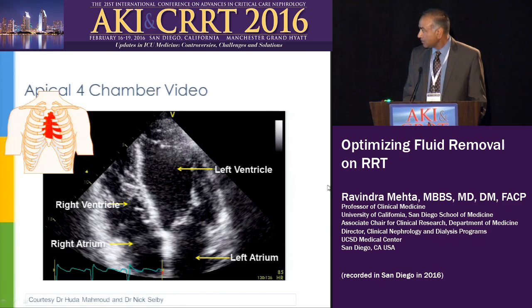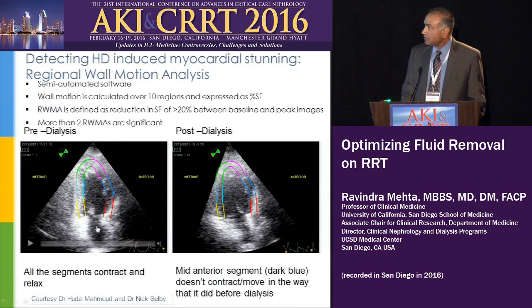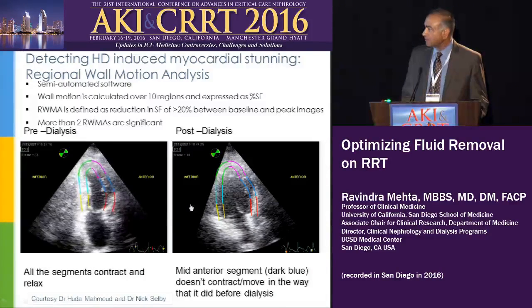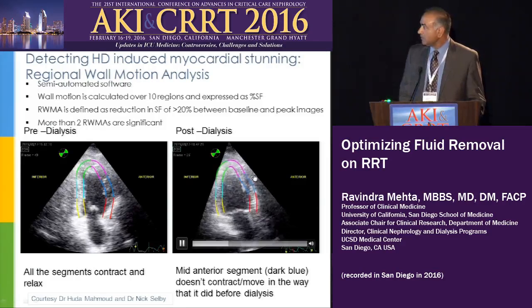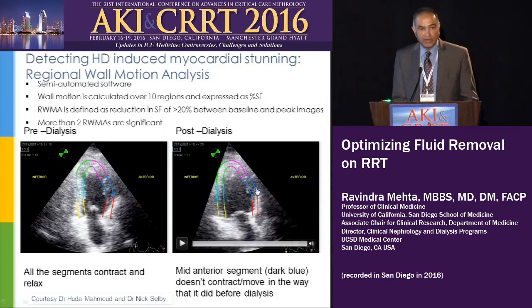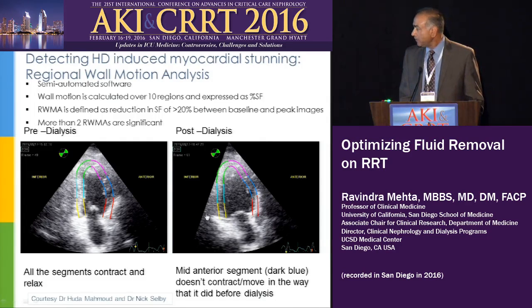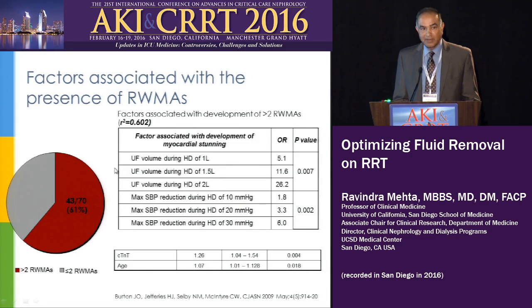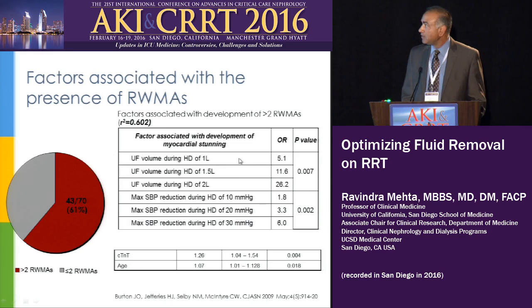When I go to the next slide, they have been measuring myocardial stunning and strain during a regular hemodialysis session. You can see here all the segments contract and relax together, whereas in this one, you can see that these segments are not contracting and relaxing together, equivalent to what myocardial stunning may be. So they feel that this may be one of the things which occurs, and what they've shown in previous studies is that this myocardial stunning is related to the rate at which you remove ultrafiltration over any session.